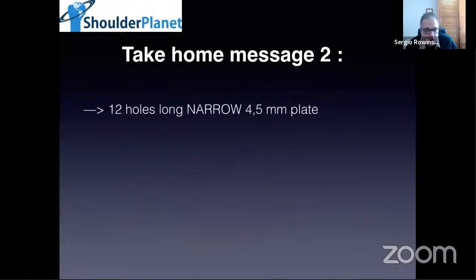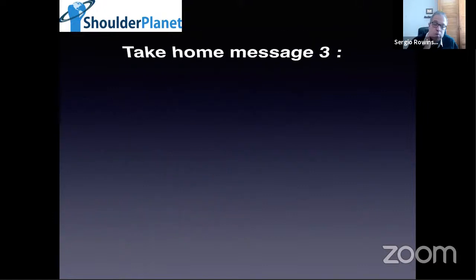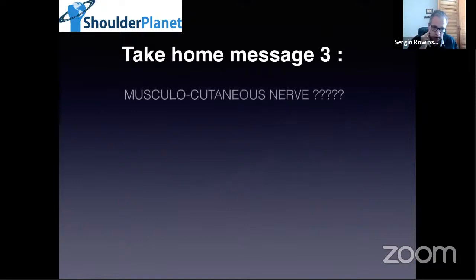This is what I do extremely cheap: 12 holes, long, narrow 4.5 plate for big fragments. 2 screws is enough, and I always do it with a DCP, which is extremely important also in my hospital because we don't have all the money. And these plates are much less expensive than locking plates.